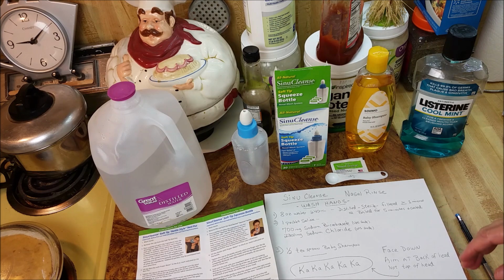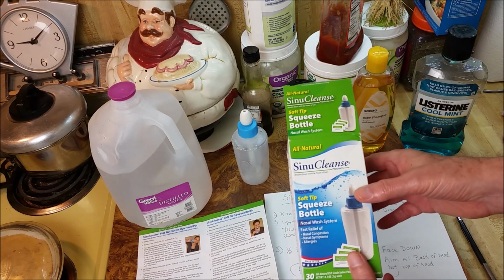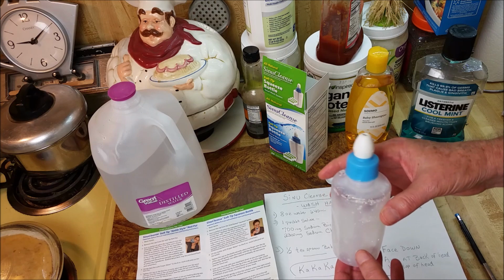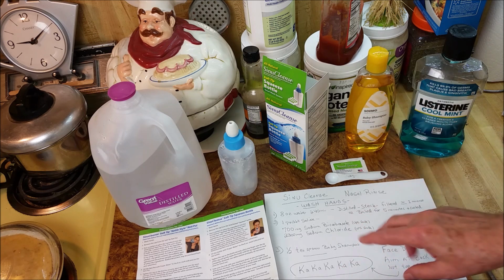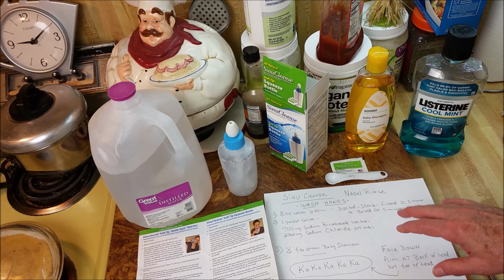Guys, this video is going to be for people who were interested in using one of these nasal rinse devices, but were terrified that they didn't want to squirt something up their nose and choke to death. I've never used one of these before, and I was kind of worried about that myself. I'm going to show you how easy it is to make up the solution and show you in writing the correct way to do it.